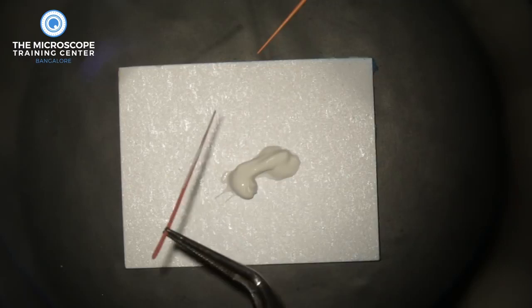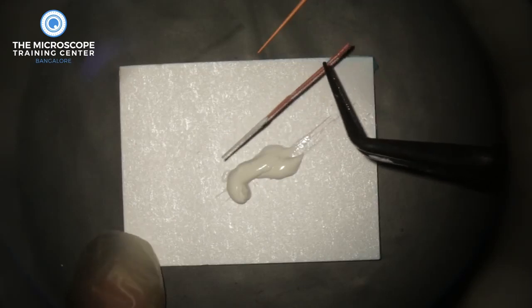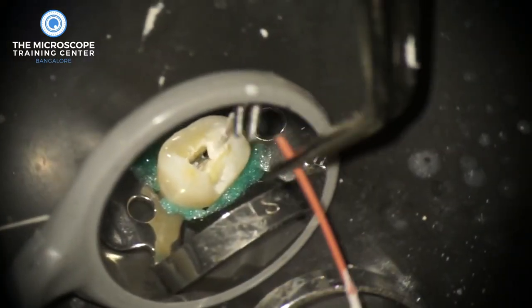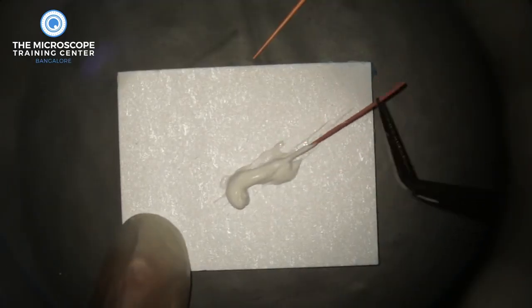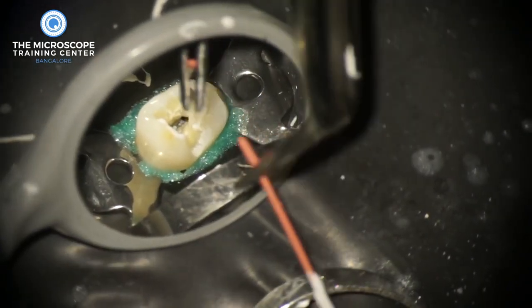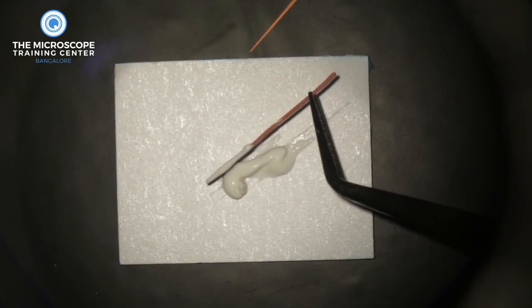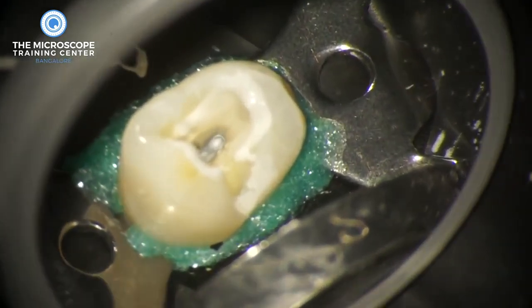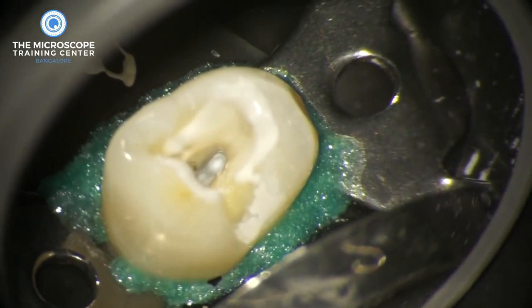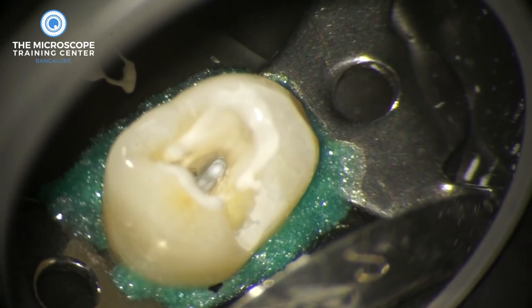Initially when you do that, the first few times there won't be any calcium hydroxide left on the gutta-percha cone, so you recoat the cone and carry it again into the canal. You keep doing this multiple times until the canal gradually starts getting filled. It's a bit more time-consuming than navy tips, but eventually there will be a stage where when you insert the cone and take it out, it comes out with calcium hydroxide still on it. When you zoom in, you'll see the entire canal gets filled with calcium hydroxide.